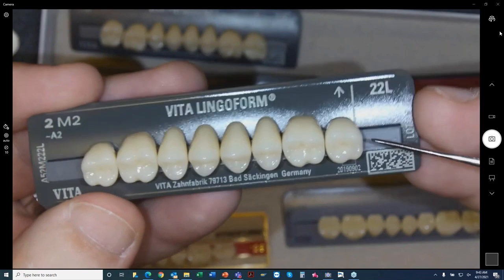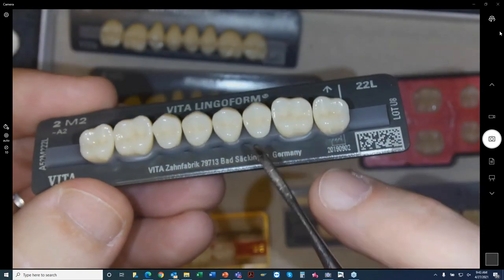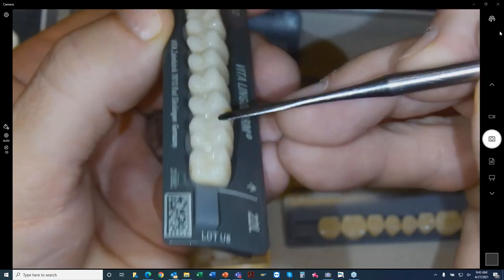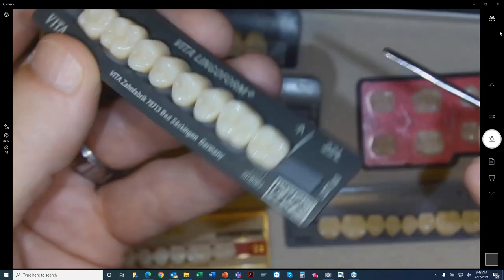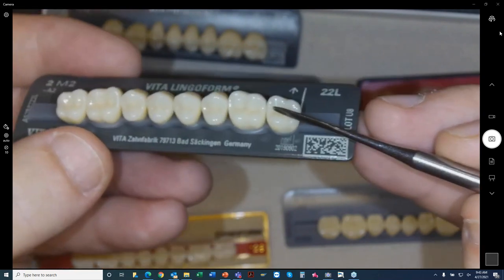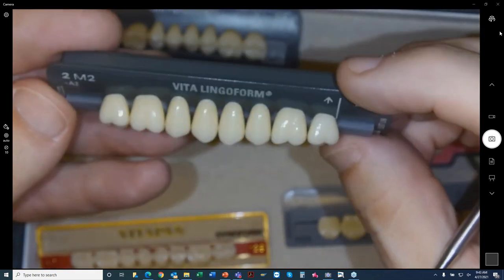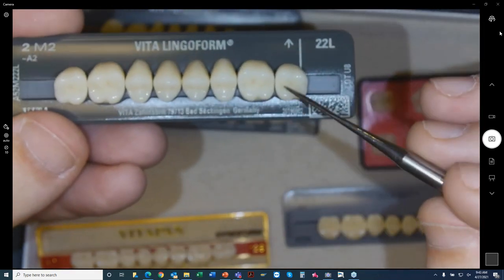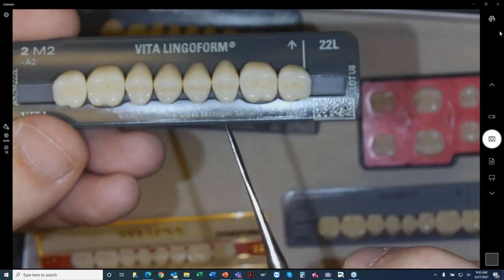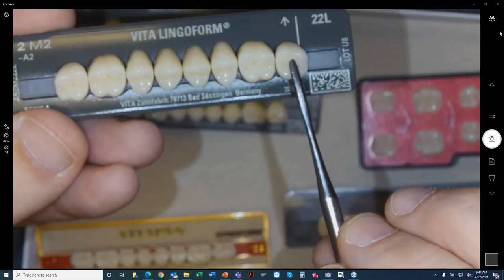And then you've got this nice one called a lingoform, which is 15 degrees on your buccal cusps and 20 degrees on your lingual. So these can be used in either a lingualized occlusion or a functional tooth, normal class one tooth design setup. So these are very nice teeth. Again, these are all 15, 20. They're about the same degree from the first bicuspid to the second bicuspid.